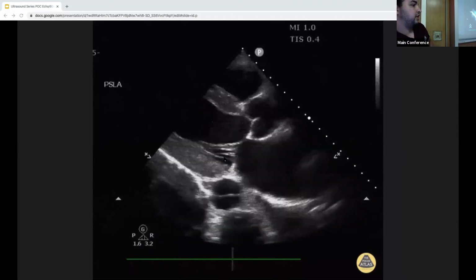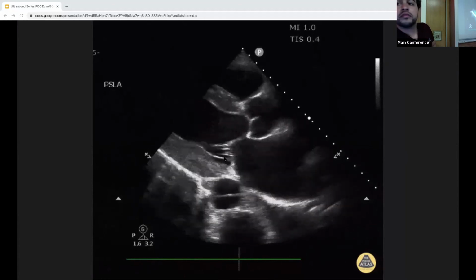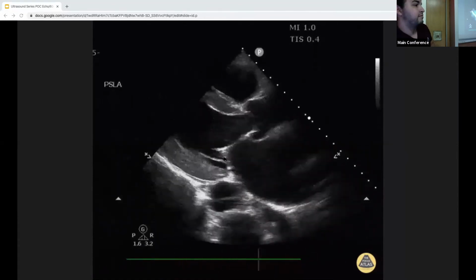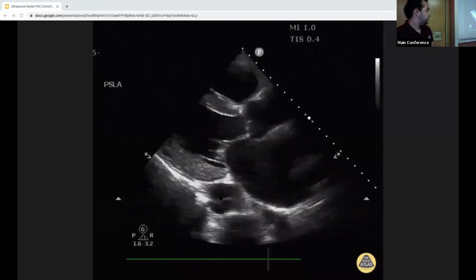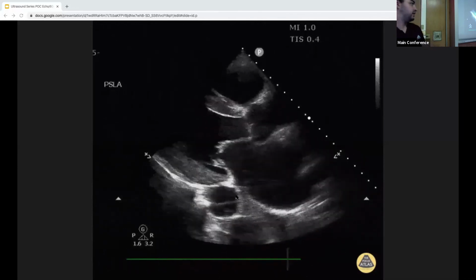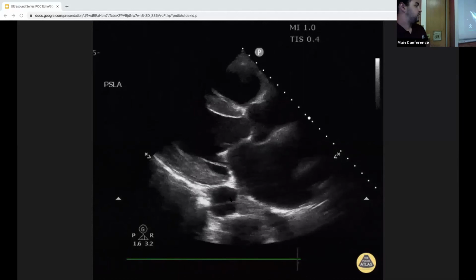I think we're still talking about exit, so think about the aorta. So you're saying the descending aorta has a flap? Yep, so this is a sign of a type B dissection. There is a flap here in the descending aorta, right down the middle. That should not be there. Anything within the lumen of the descending aorta is a sign of dissection, so this should have you worried.